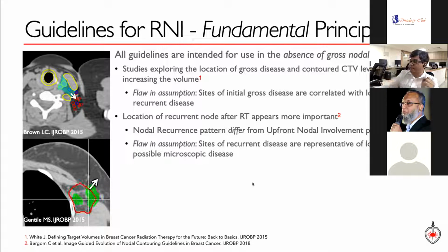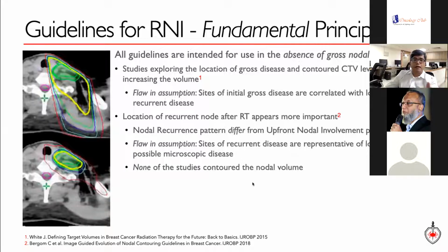It absolutely ignores the fact that there is a biology behind breast cancer. There is an aggressive biology, there's a less aggressive biology, and we don't know whether it's bad biology or bad technique, and whether we need to change. And interestingly, in all of the studies that I'm going to show you in the next couple of slides, none of these studies had actually contoured the nodal volume. They had treated all of their patients using three-dimensional techniques.